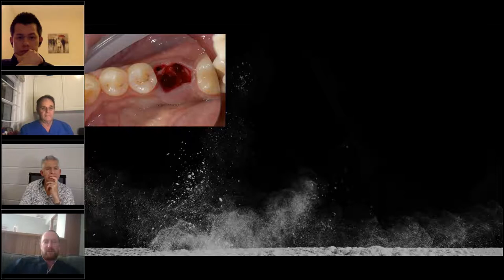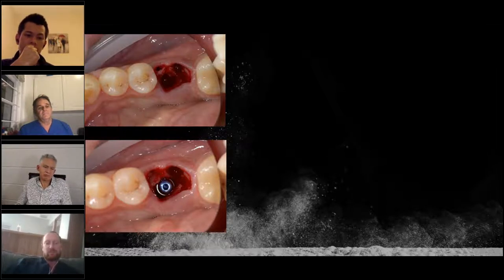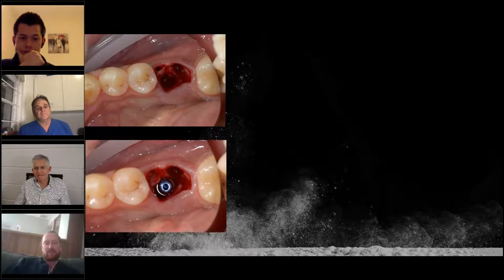It's actually good to have also densification, and you can spare the bone that's left in the furcation area. We place the implant, and I put the cover screw in this. You can actually put the implant into the site simultaneously as you use the EthOss with a slightly wetter mix. But in this case, it's quite easy to use the big syringe of the EthOss and just push it in. So for the molars, I actually prefer to do this. And the molars are also one of the positions where I prefer not to raise a flap, because we have the access and we can pack the EthOss into the site.